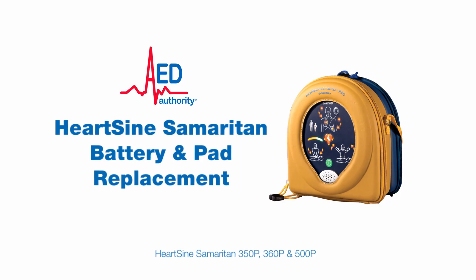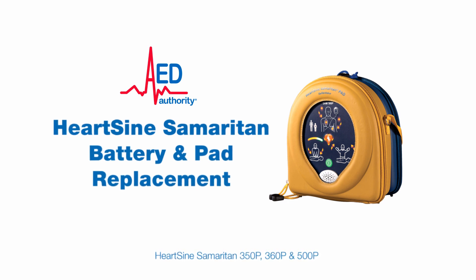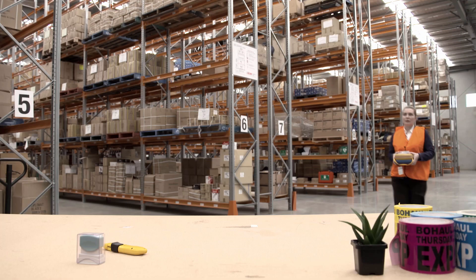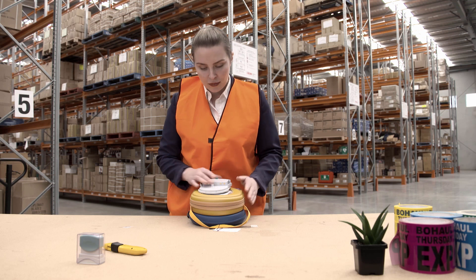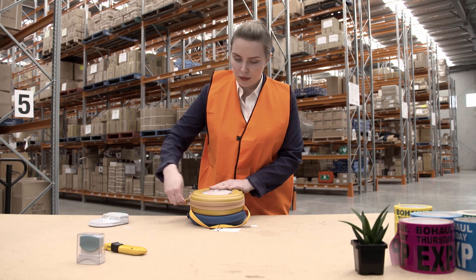In this video we will show you how to change the batteries and pads of a Hartsign 350p, 360p and 500p defibrillator. After using your Hartsign defibrillator, or after four years since purchase, you will need to replace the battery and pad pack.